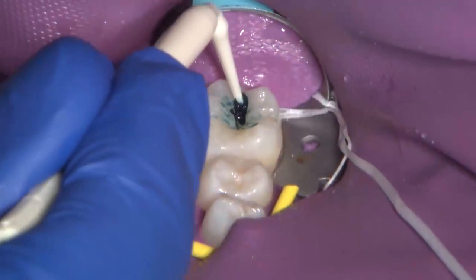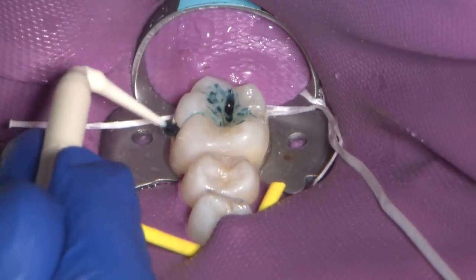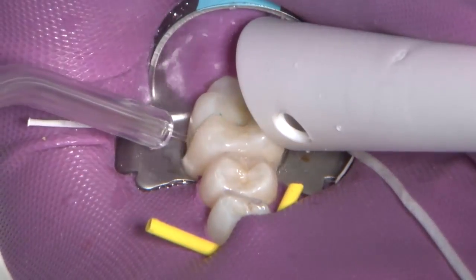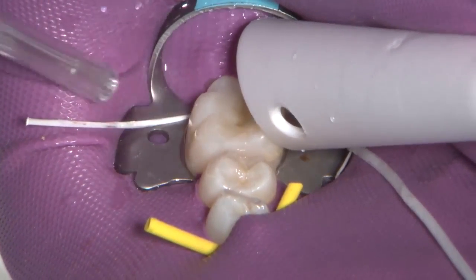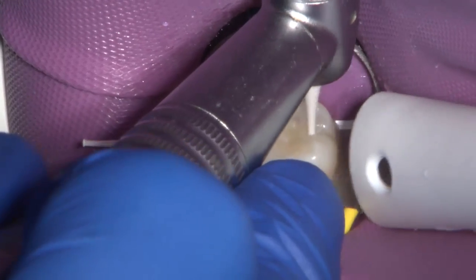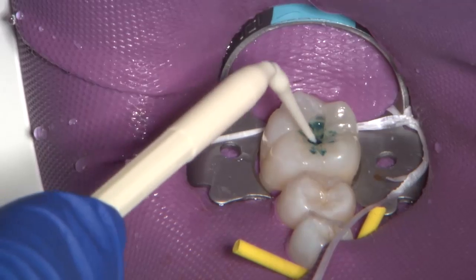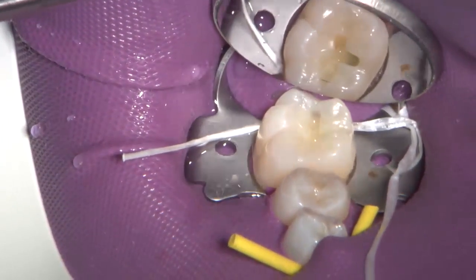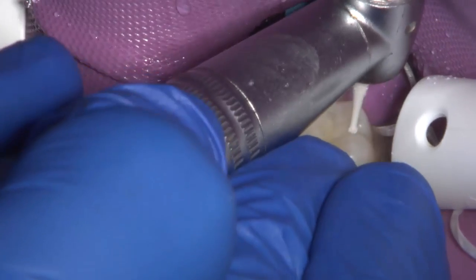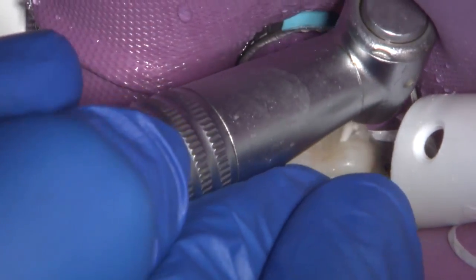A caries detector dye is used to stain the collagen that has become denatured by the caries process. Although this is a simple Class 1 preparation, this type of preparation can be challenging. The shape of a Class 1 preparation is described as having the highest configuration C-factor and is the most susceptible to the effects of shrinkage stress. A round bur in a slow-speed handpiece carefully removes all the stained, infected soft dentin.